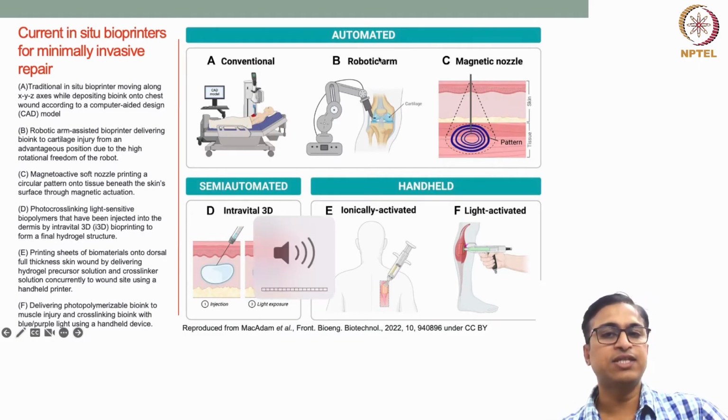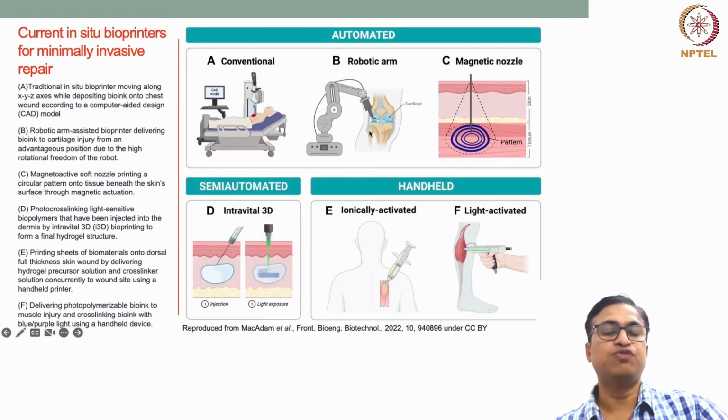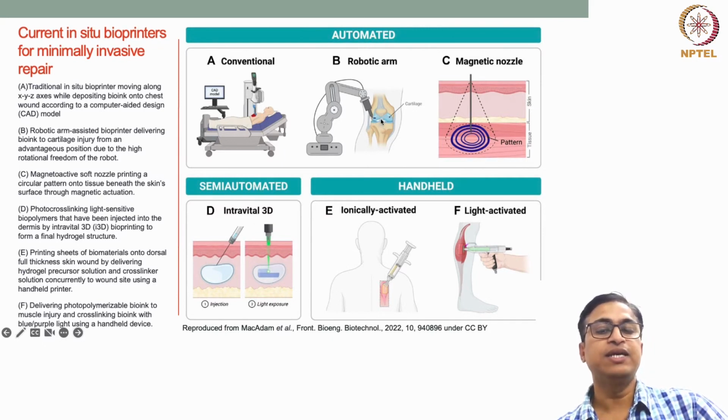Next, for bioprinting in some anatomical location that cannot be accessed from the outside without opening the wound, robotic arm assisted bioprinters can be very helpful.